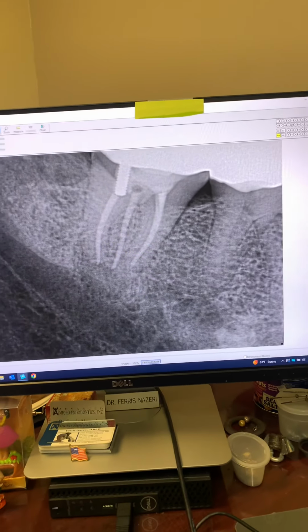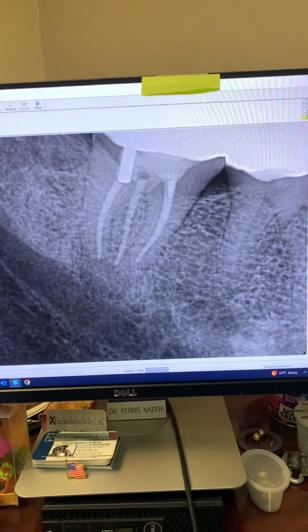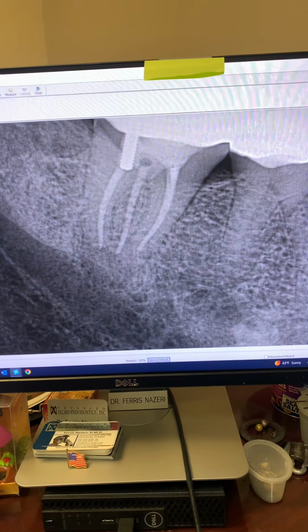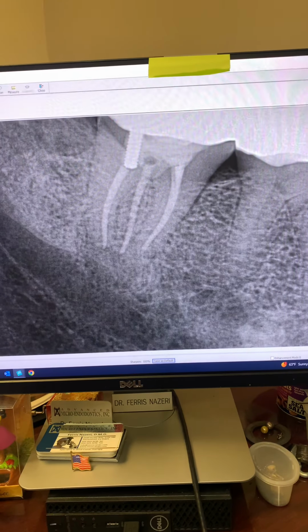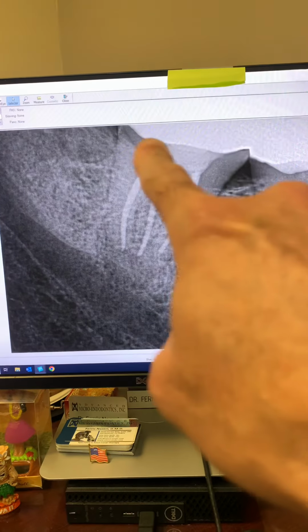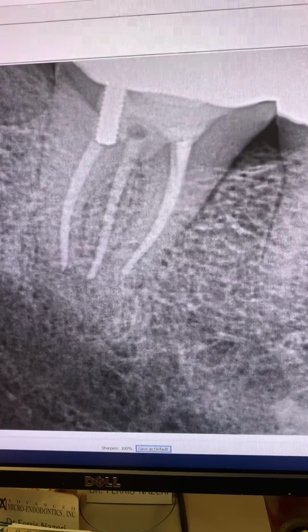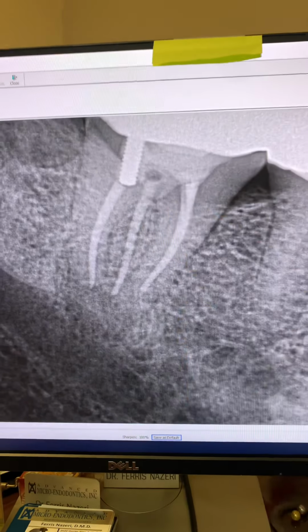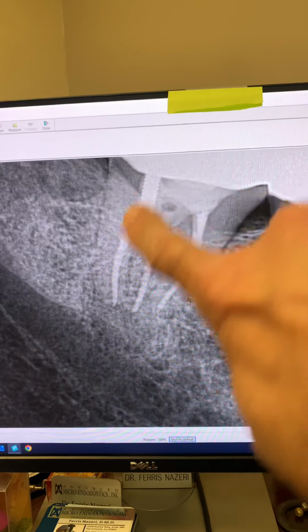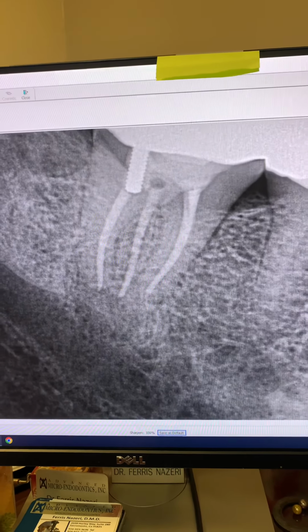This patient was referred to me for endodontic retreatment of tooth number 31. Patient had pain and there was a buccal parulis associated with the tooth that I will show you in a few minutes. As you can see, porcelain crown, prefab metal post, useless. That's a useless post, other than perhaps causing a vertical root fracture, splitting the tooth.